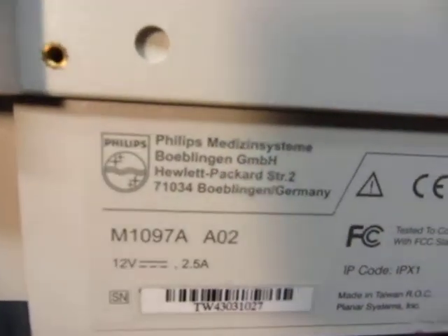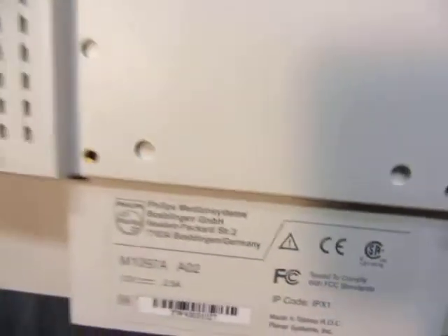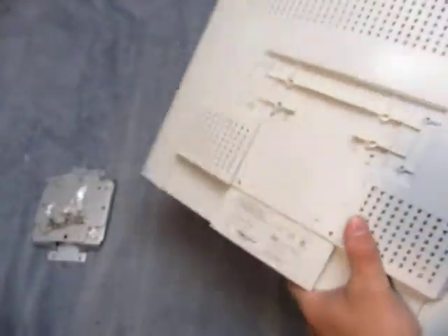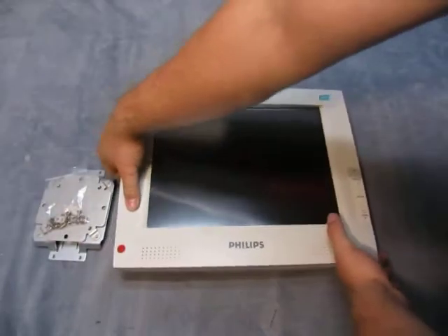Again, here it is — M1097A — and a bracket. There's a little bit of marking and some tape on them, but besides that they are in good shape.